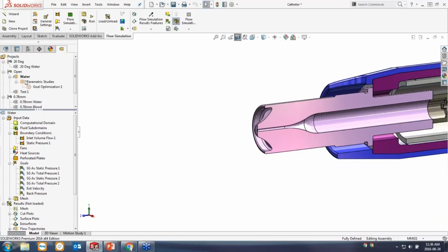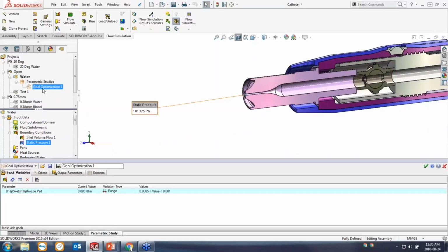So I ran a study, I've called it water, had the same setup as test one, same inlet volume, static pressure, and goals. But I've added to that a parametric study where I've supplied a dimension. I double-clicked on the 0.5 millimeter dimension inside my nozzle, and I specified a range from 0.5 millimeters to 1 millimeter. The units for this here are meters, so it's a factor of 1,000. And then I gave it a criteria.